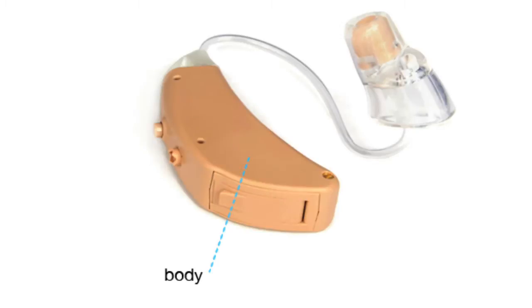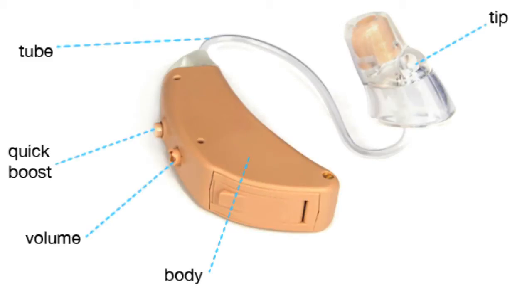This is the body, the tip and tube, volume control and sound boost, battery door and retention cord.